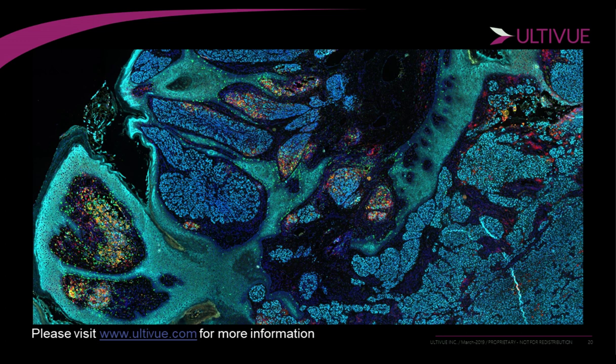Since we put SOX10 and cytokeratin in a cocktail and they stain different compartments, SOX10 is a nuclear compartment stain versus cytokeratin, which is more of a cytoplasmic stain, you can very easily do a cell segmentation using pretty much any analysis software to differentiate these two compartments. So you can actually get 5-plex data. It also allows you to use a single type of kit for melanomas versus carcinomas.